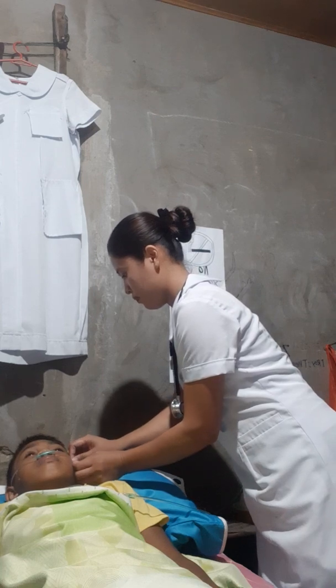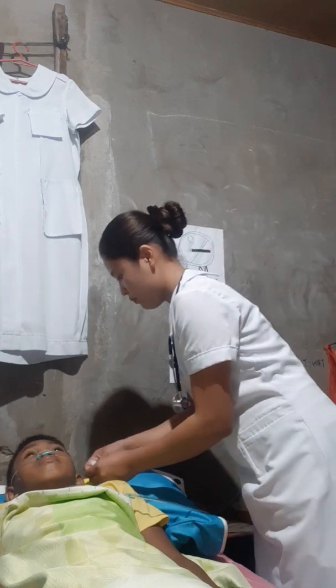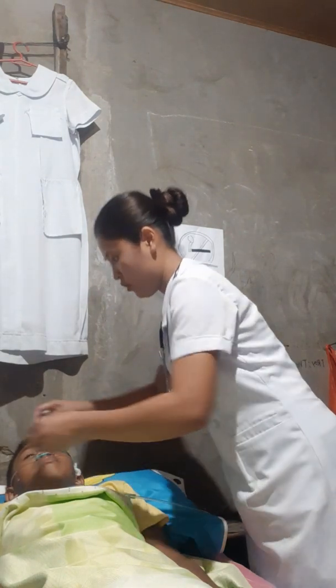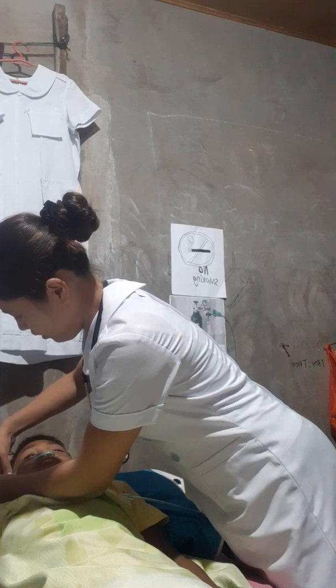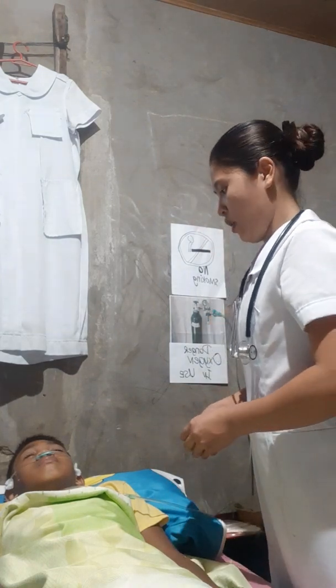Afterwards, please pad either ear of the client to avoid irritation. It should be at the cheekbone on either side, for both ears of the client. Then encourage the client to breathe through the nose and close the mouth.